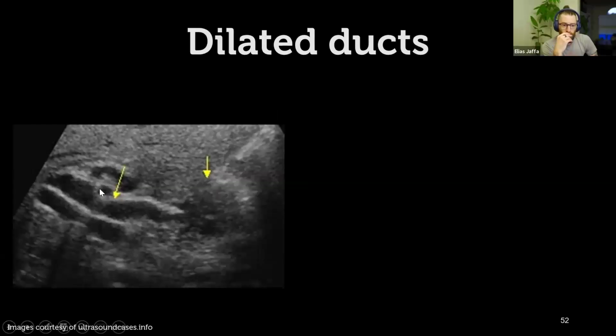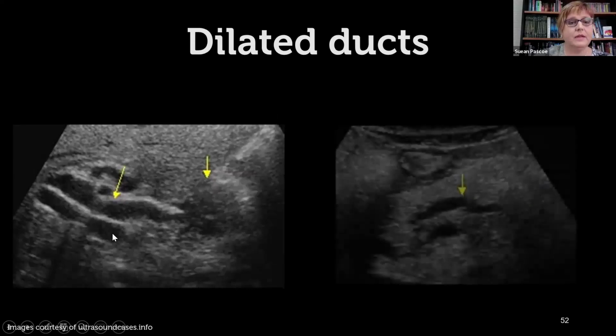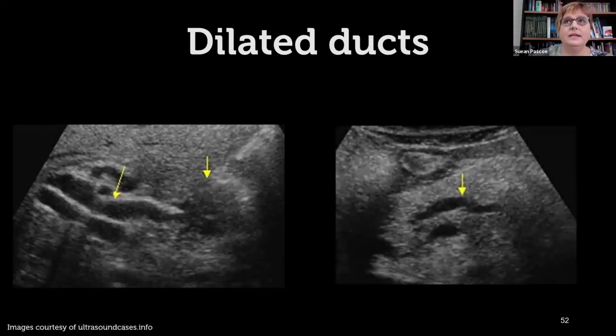What's really striking about those? Double barrel shotgun. So we've got hepatic artery here, the bile duct coming underneath, and then here's portal vein. And here's the pancreatic duct in the pancreas. So we've got the vessels here. And again, in this particular image, it'd be handy to have the color on because you'd see that this is a vessel and then this bit is a dilated pancreatic duct. When they're that easy to see, something's not quite right.